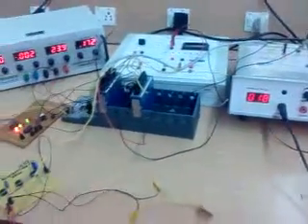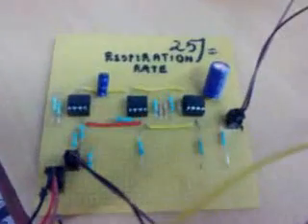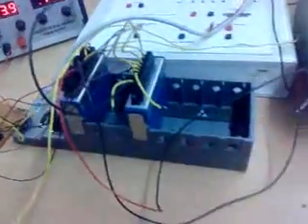Whenever we connect the vibrator to the output, whenever there is an abnormal activity in your respiration rate, the vibrator will turn on, which will disturb the child's sleep or the person's sleep, and that may restore the breathing of the person, because in sleep apnea most of the time people forget to breathe. That's the reason why it causes a fatal effect. So this is all about the entire setup.